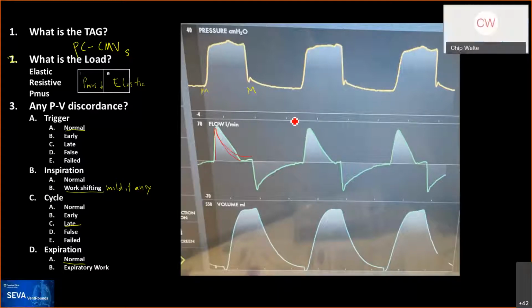Well, I suspect yes, but let's see. Why would you have an increase in flow? Oh, maybe if some airways popped open, you'd get a sudden increase in flow there. No, you get a decrease. No, yeah, I'm sure there is, but I can't think of it.